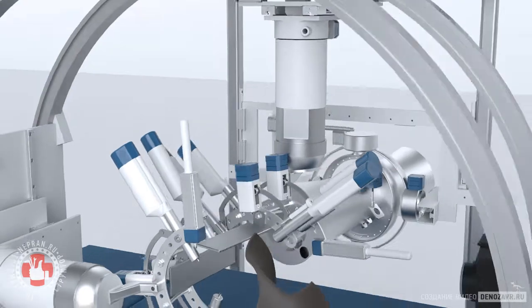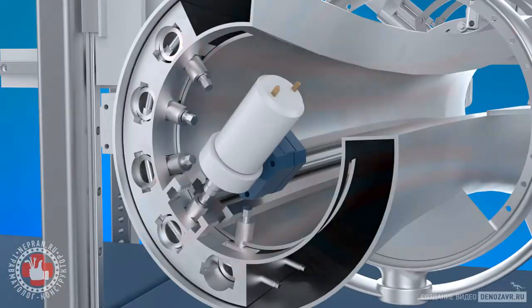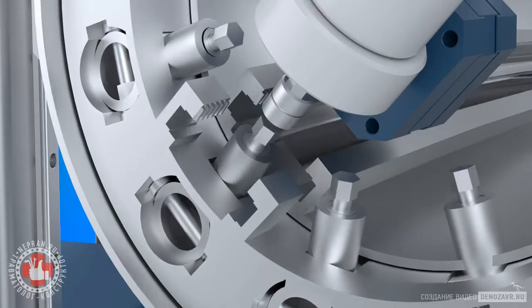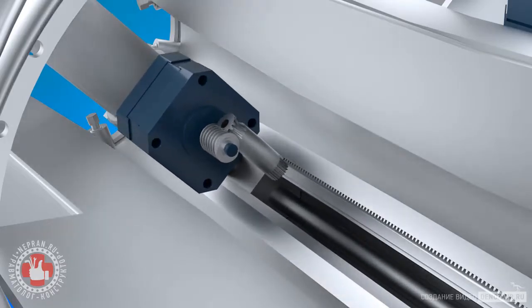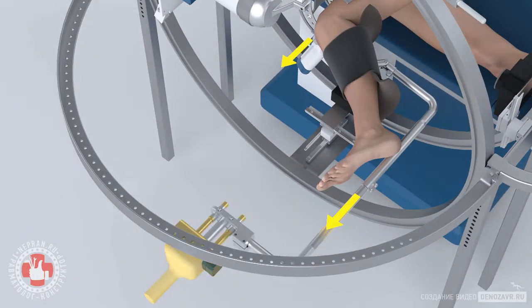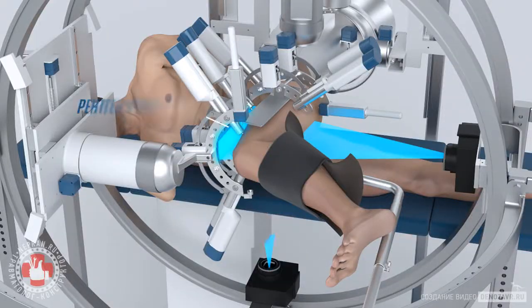The third manipulator controls a multifunctional tool, with a store of scalpels, the same device for drilling the intraosseous canal along a given radius, and the intraosseous shaft with a bend along the same radius. After preliminary stretching, an X-ray control is performed. On monitors, the image of fragments obtained from visualizers is supplemented by data from a computer.